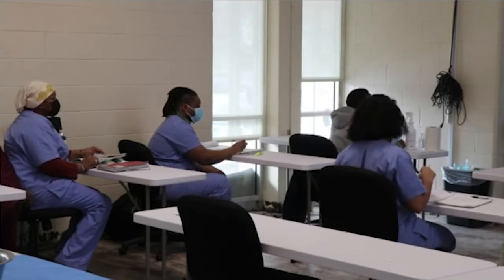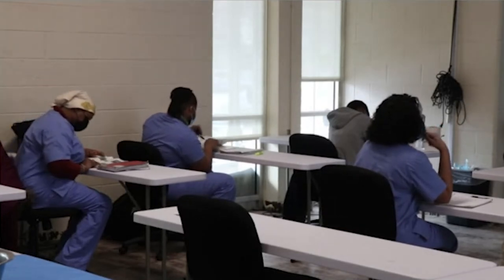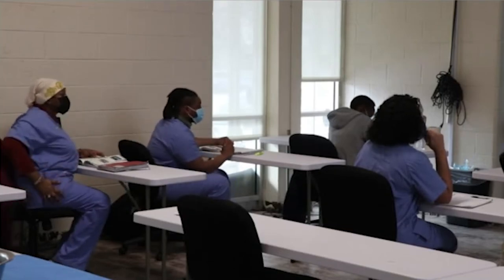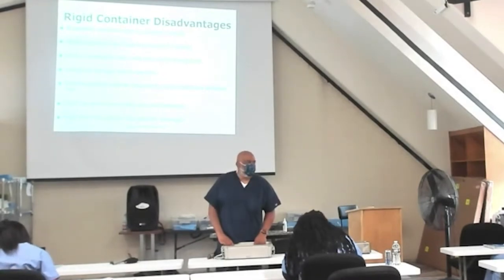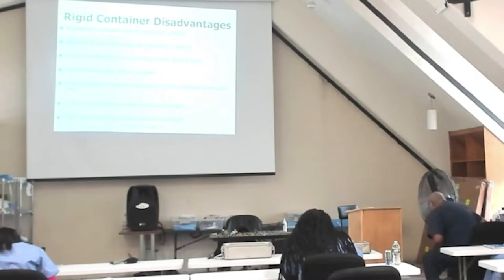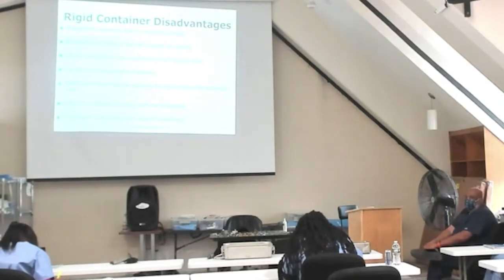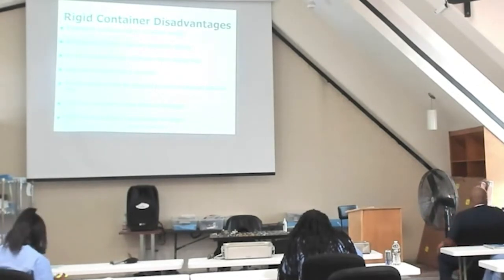Our filter retention tapes keep the filter locked in. Now, what about the filter? Can we use them over and over again? No. We change them. Do we inspect them? For what? Excellent. Holes. And just like when we put the filter retention plate in the tray, whether it's on the top or bottom, we want to make sure it's secure, because if it becomes dislodged and the filter is no longer in place, then what happens to the tray? Contaminated. Great.